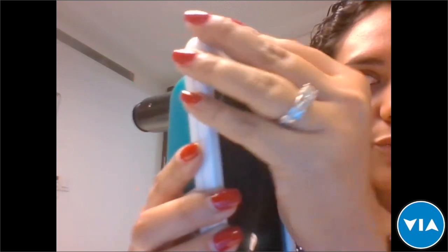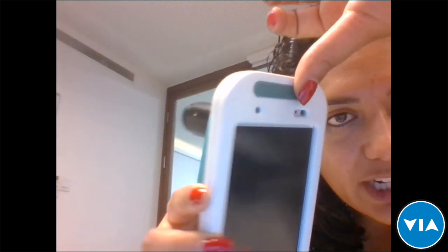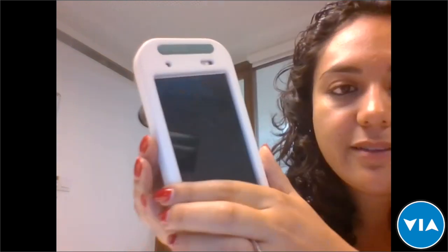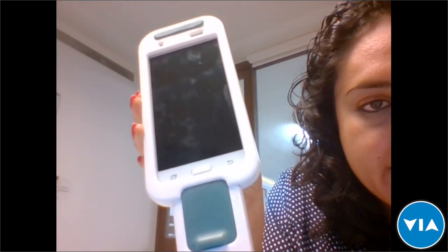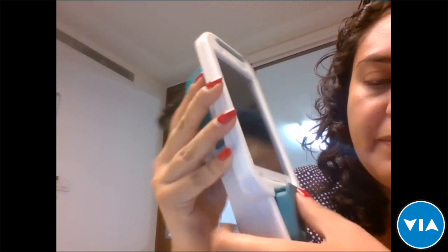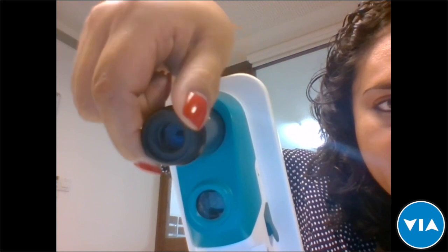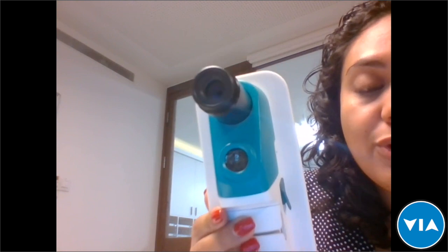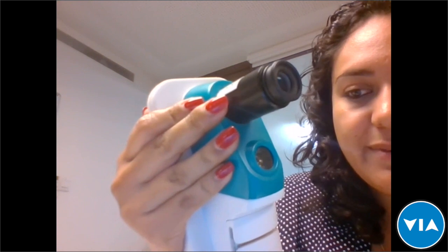So you're able to remove the phone if you want to insert it for the first time with a SIM card by simply using some Allen screws in there, and this pops out. The button for turning on and off the light is here. The charger for the phone is right there. And then you can see here's your lens, and you have a manual focus at the end. You can also focus by moving further and closer away from the patient the way you would with a standard colposcope. And that's the light again. So that's what you have here.